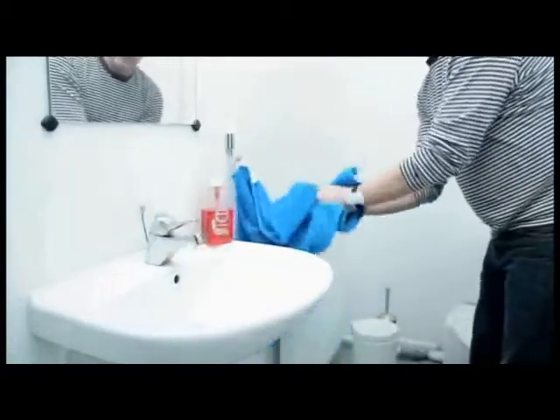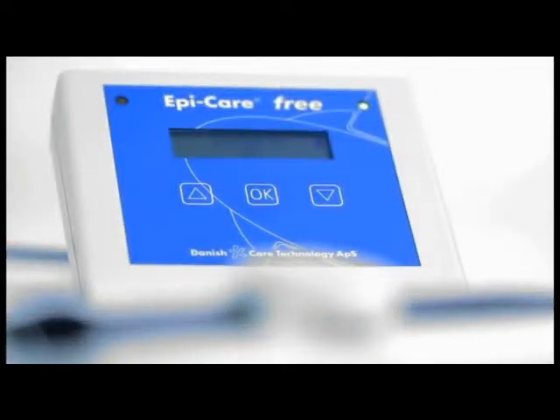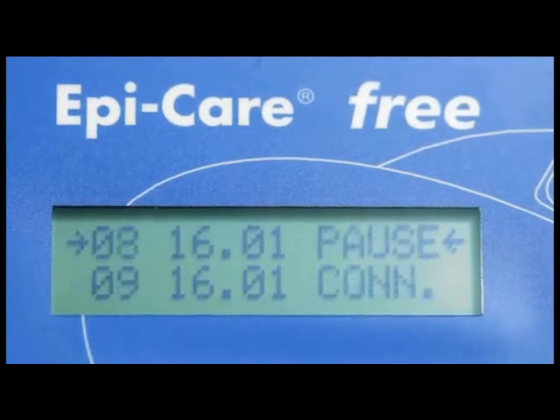The EpiCare Free device continuously monitors the sensor's battery level and whether the sensor is within range. It also sends a signal if monitoring is interrupted. The control system registers the time of alarm episodes in a log, making it easy to keep a seizure journal.